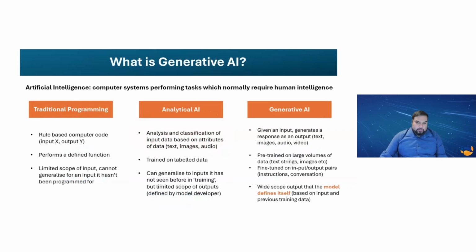From the left, it's important to start with traditional programming. For input X, output Y. We have simple programs like this working for us all the time, but their limitation is that they can never deal with an input they haven't been programmed for.